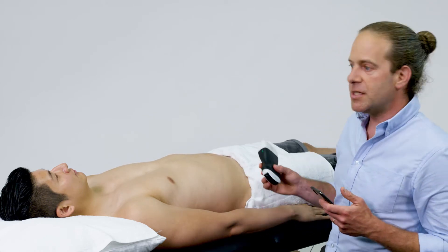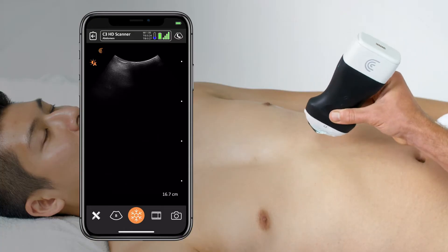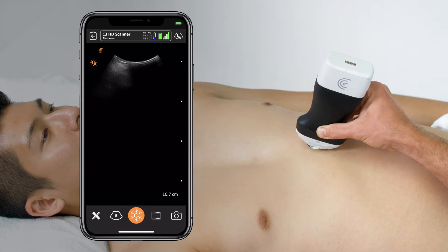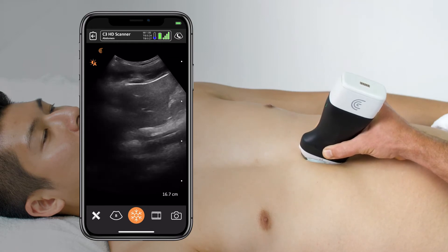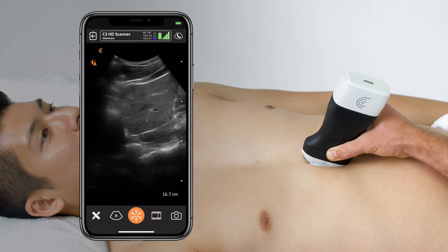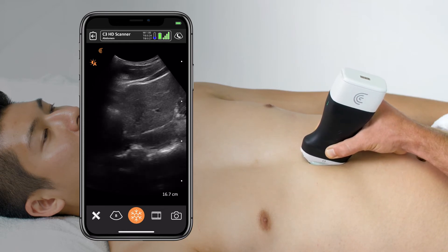To perform this scan, I'll take the indicator towards the patient's head, and the quickest way to get this scan is to put the middle of the transducer right on the xiphoid process. From here, I'll slide the transducer ever so slightly to the patient's right until the IVC pops right into view.